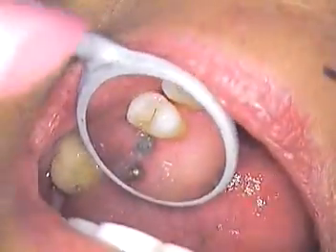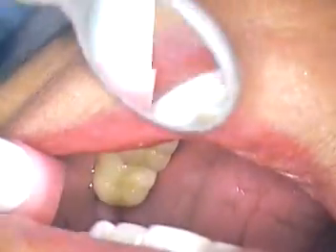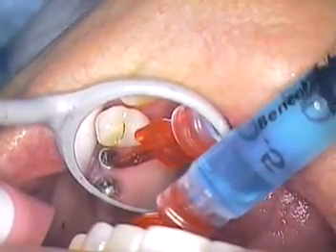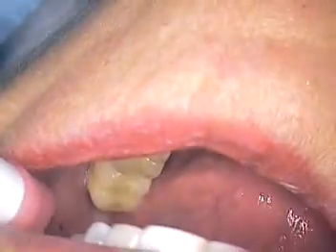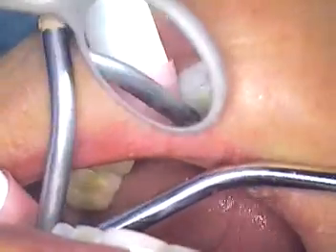Alright, mirror. We're back in gently now. We'll put a cotton roll up in there. We know she's not numb now, so we'll go nice and easy. And squirt a little bit in there, squirt a little bit in there. And we'll rinse that thoroughly. It tastes like soap because that's exactly what it is.